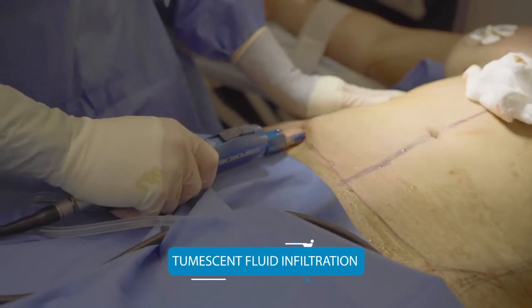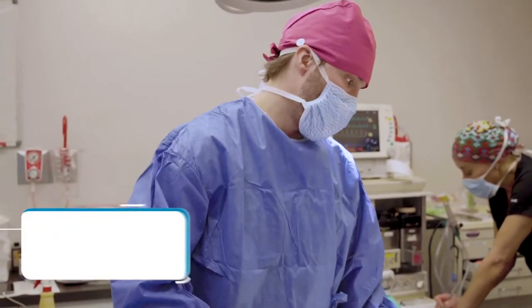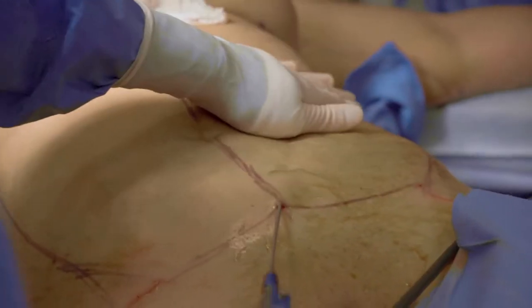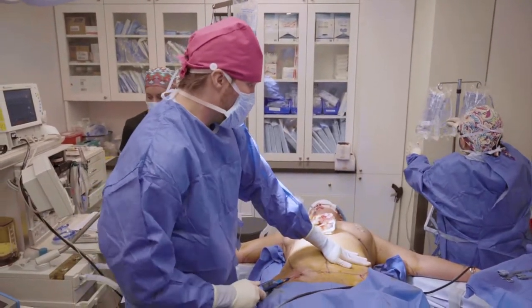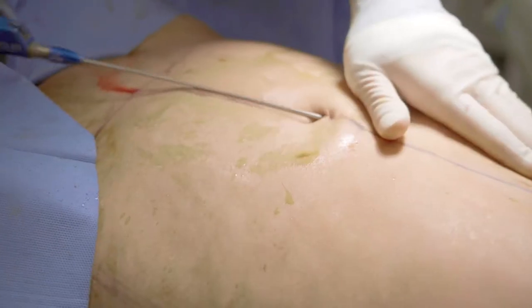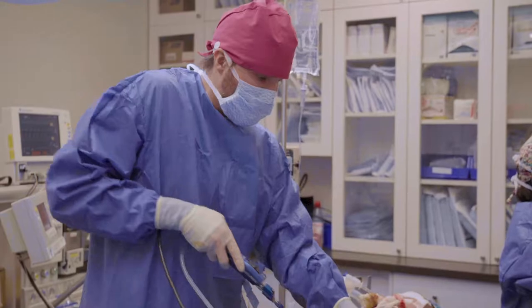So we are doing revision BBL and breast surgery. I'm numbing everything up, and I'm going to numb the breast at the same time so they'll be ready when I do the implants. But first, I'm going to do the BBL. Every time I do a revision, it's a little more tricky because I don't know how much fat there is. Sometimes you think it's fat but it's scar, so you never know exactly until you do it how well the fat will come out.